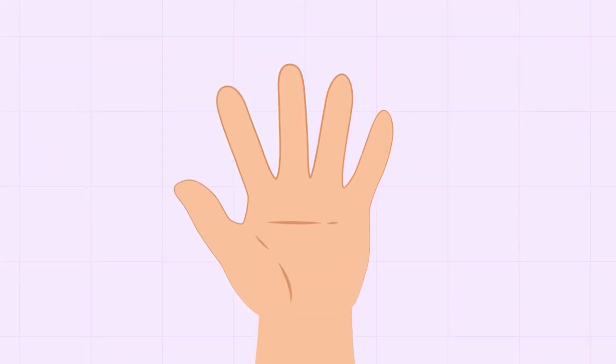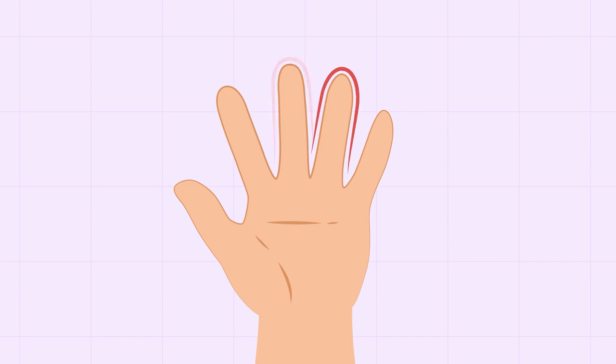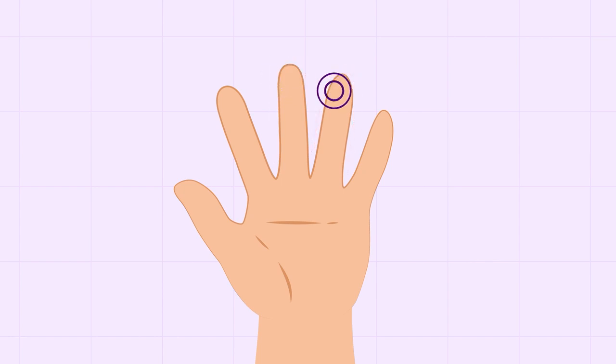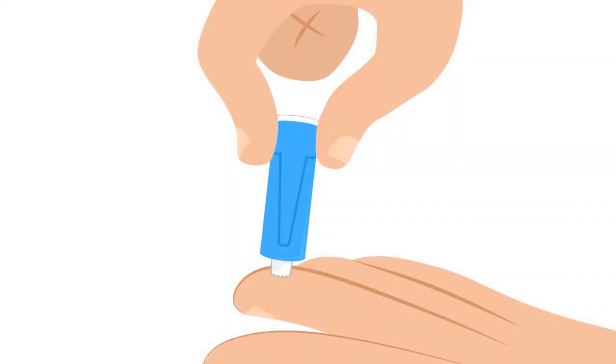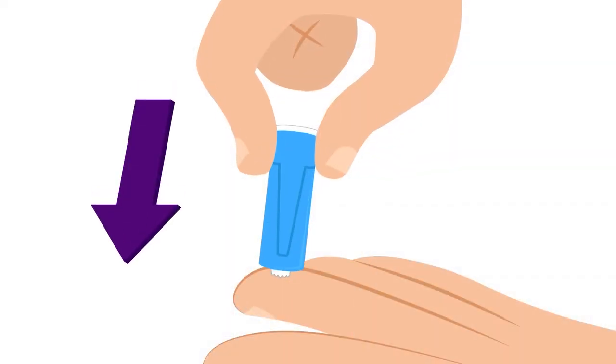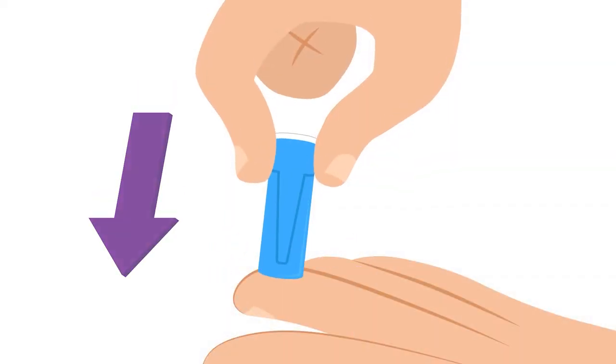To prick your fingertip, lay the finger you intend to collect your sample from on a hard surface. Use the middle or ring finger on your non-dominant hand and lance off center on the fingertip. Apply firm pressure to the end of the lancet until a click is heard.